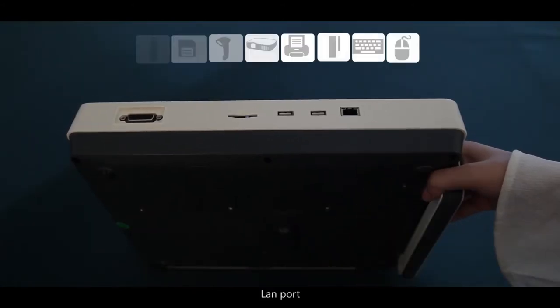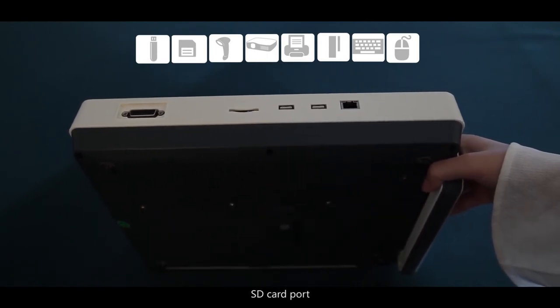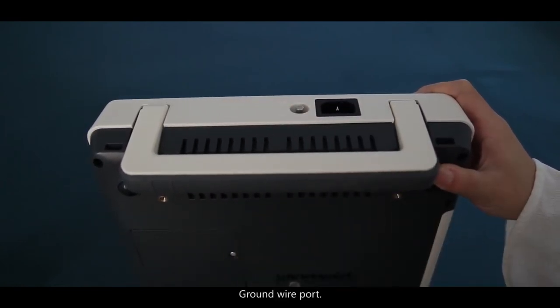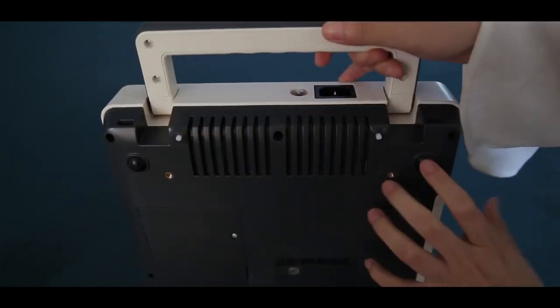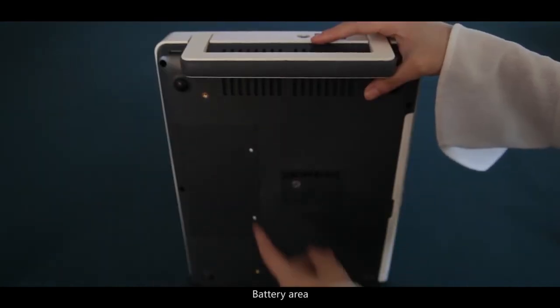LAN port, two USB ports, SD card port, patient cable, power port, ground wire port, handle, and also a holder. Battery area.